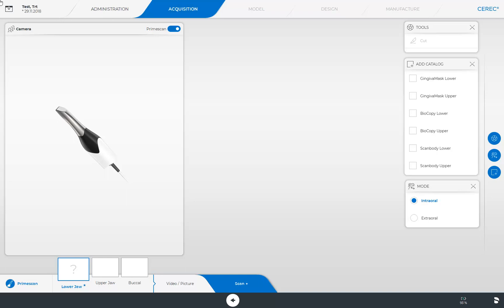During the scan, any areas of interference, such as the tongue or cheek, are automatically detected by the algorithm and eliminated. Should you still want to remove additional scan data, you can use the Cut tool for this purpose.